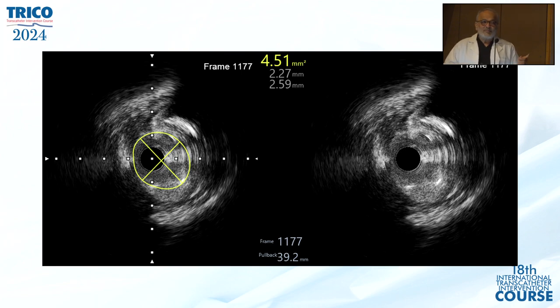So let me tell you, this was the case I did in Professor Mil Jamaluddin Center, and follow-up angio done after 1 year was clean. Unfortunately, Professor Mil Jamaluddin could not come. He was supposed to come with this angiogram. So the message here is very clear: if you do imaging, just make sure that you interpret it properly, and give proper time for the interpretation.